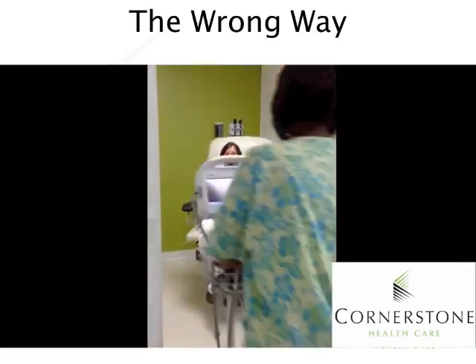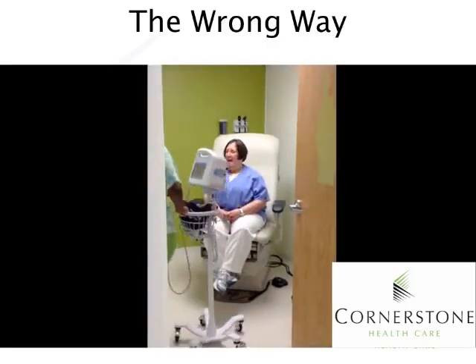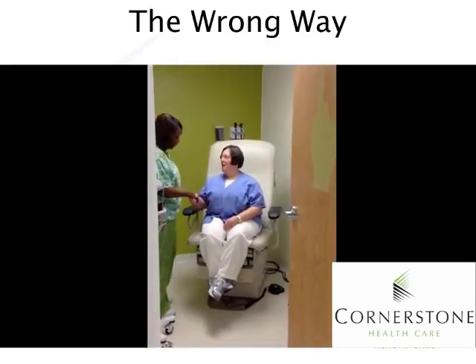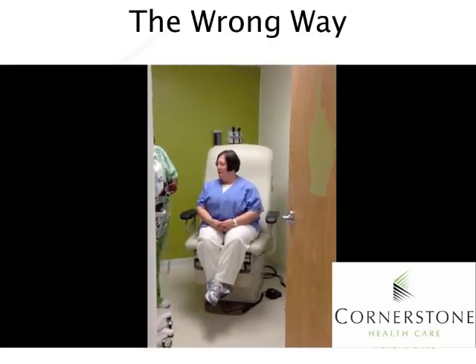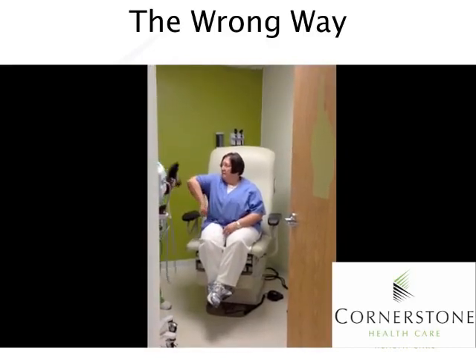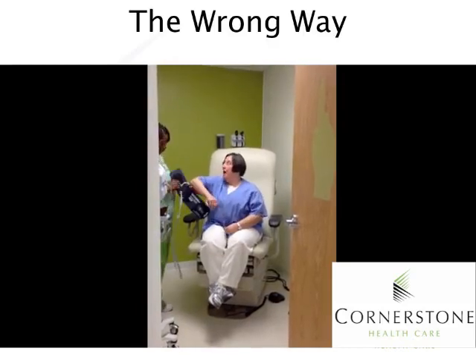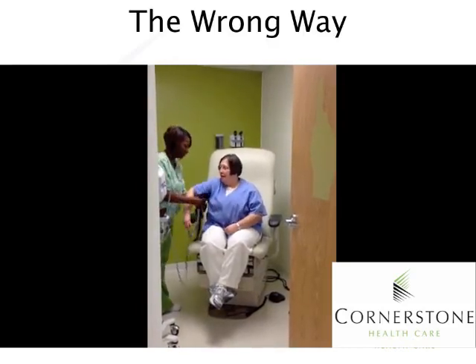In the wrong-way demonstration: the clinical staff member greets the patient — Hi Ms. Susan, how are you today? — and the patient mentions she has pictures to show. The staff member engages with the patient about the photos, talking during the blood pressure procedure, and even calls a coworker into the room to see the pictures while the blood pressure cuff is on the patient.